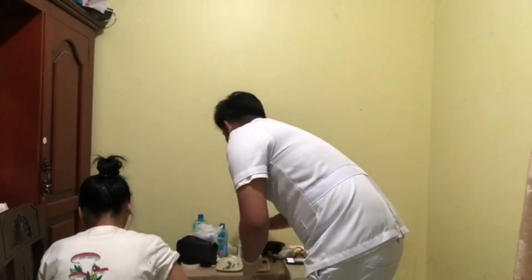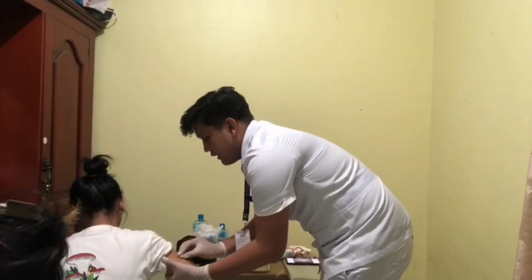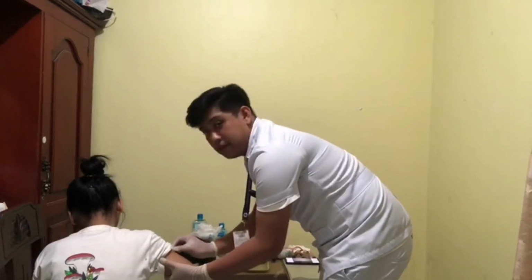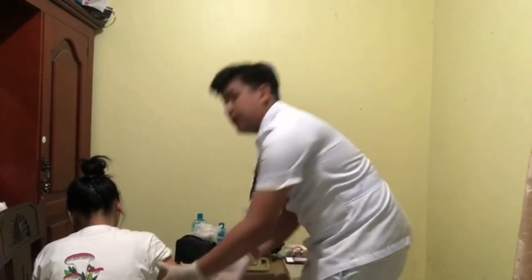So next we'll now clean the site, and we have an antiseptic swab. So using a circular motion, start at the center and move outward about 5 centimeters to disinfect the injection site. Okay, ma'am, I am going to perform disinfection, and it is for 5 centimeters in a circular motion. Okay, discard. Thank you.